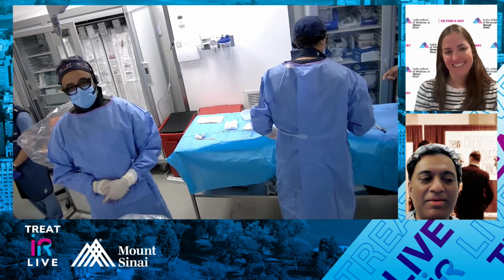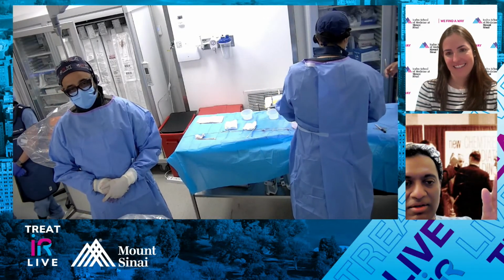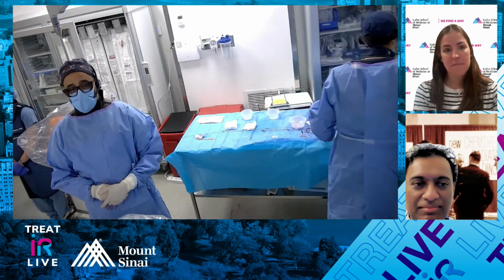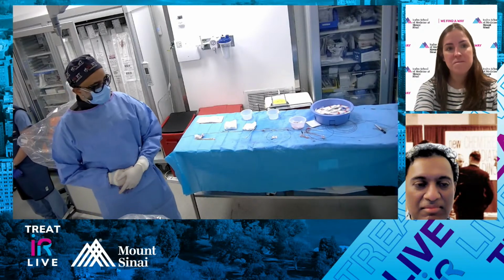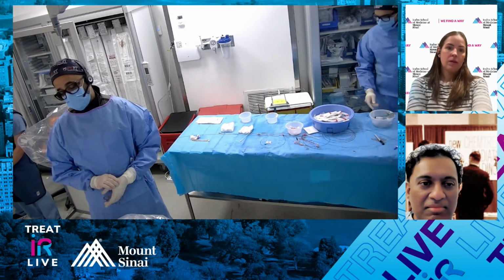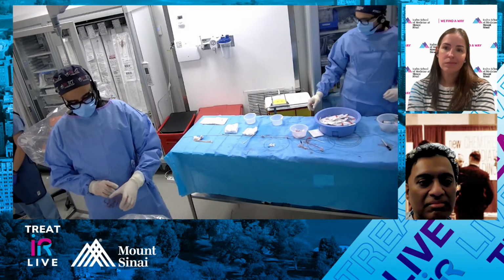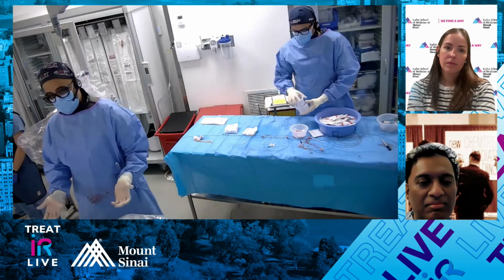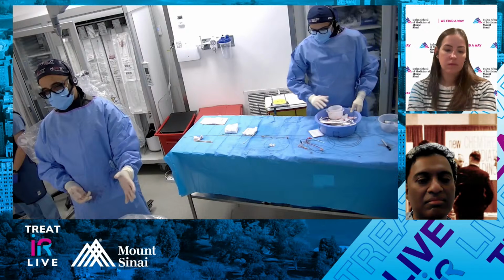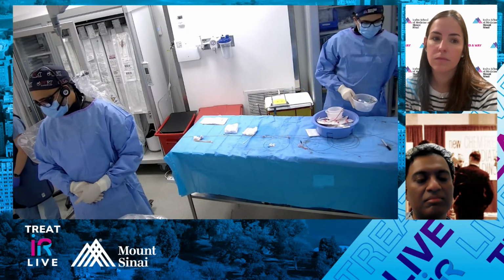Let me add one other question. I've seen people do this kind of snuff box or distal radial. Do you use it, and if so, when? We haven't used it a lot. We did for a short period of time try to use the snuff box access. People say it's more comfortable. I don't know if it's safer or anything like that. In terms of positioning, you can leave the hand in a more neutral position with the hand up.